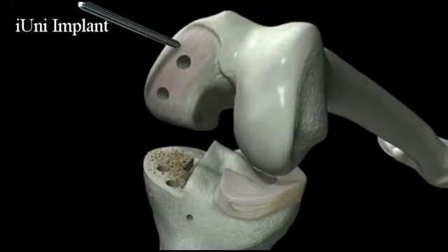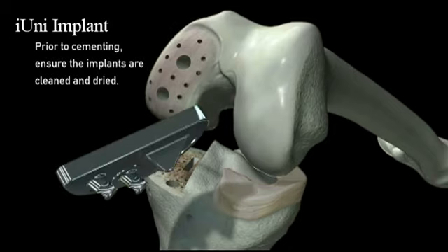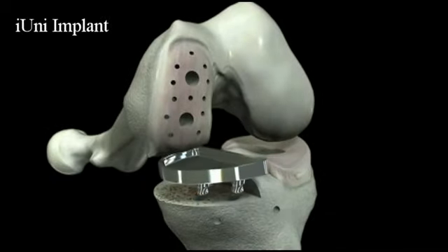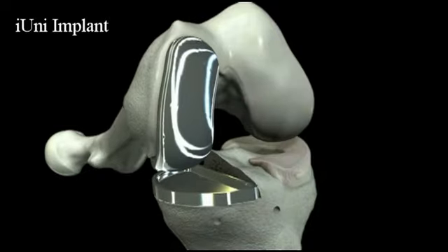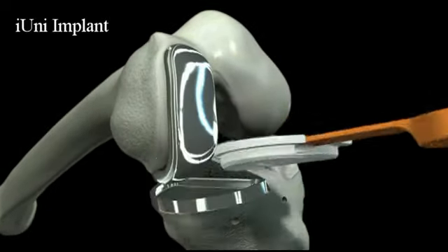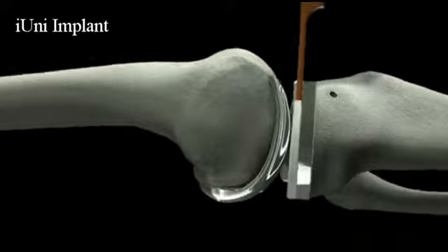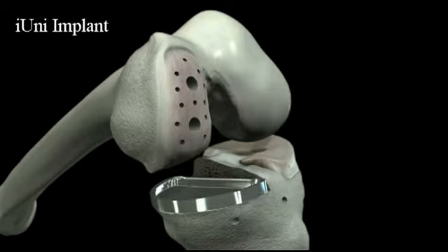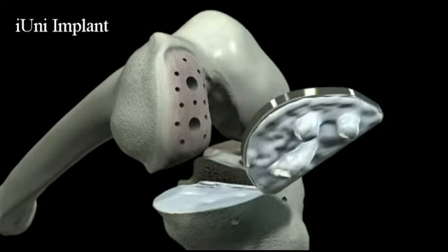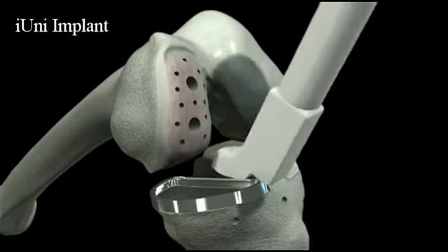Step 6. Using a perforator drill bit, drill approximately 8 to 10 cement holes to enhance cement interdigitation on the femoral cortical surface. Place the metal implants into position. Next, apply a layer of cement to the tibia, filling holes and covering the bone surface. Then impact the tibial tray using the tibial impactor tip.